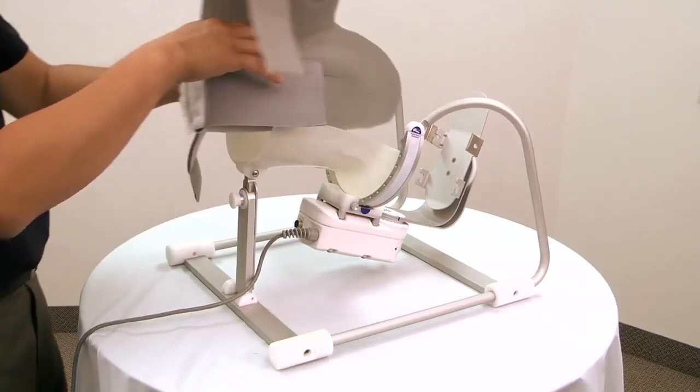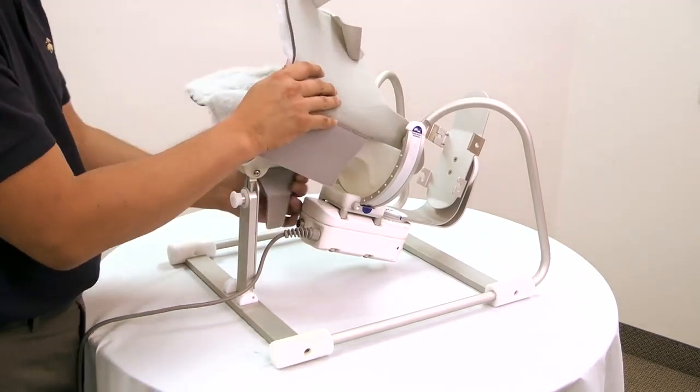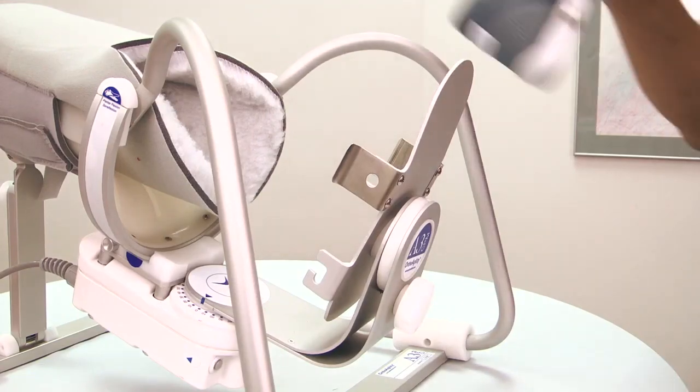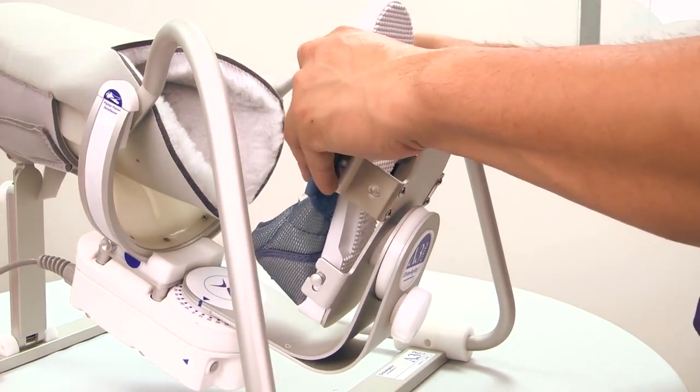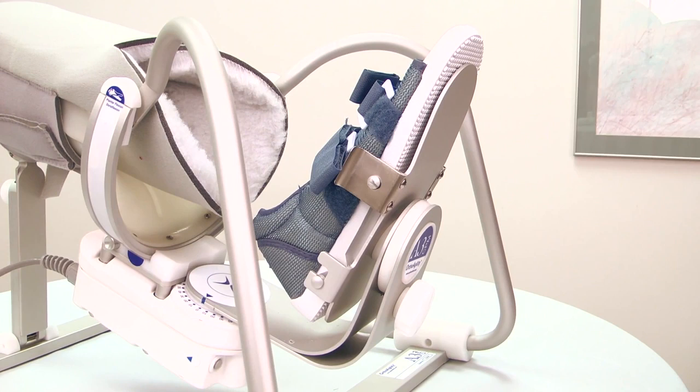Next, attach a new patient kit. Slide the lower leg soft goods onto the leg shield and the hand soft goods over the patient on-off button. Then attach the orthopedic shoe by engaging the rear shoe posts into the rear slots and the front shoe posts into the front slots. Now we're ready to fit the unit to the patient.